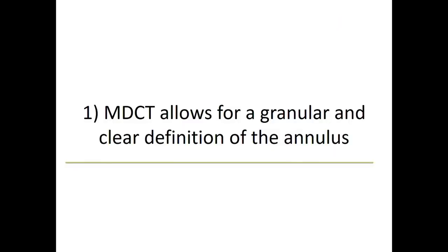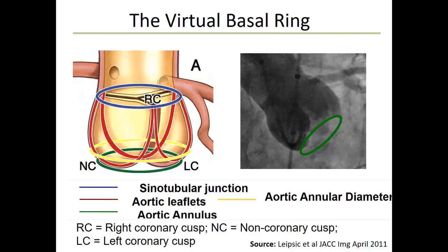So what are the outstanding challenges? One is that we continue to move forward around annular sizing. I think we helped move the field forward a lot by introducing the very concept of the non-circular annulus, as shown to us by Nico Piazza 11 years ago in Circulation: Cardiovascular Interventions, and really highlighting that CT allows us to recreate this virtual basal ring that is very much the landing zone of the device.